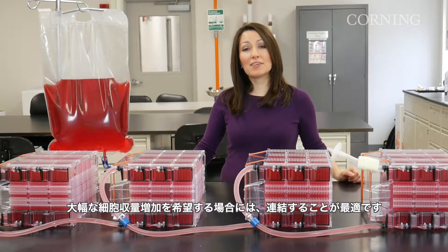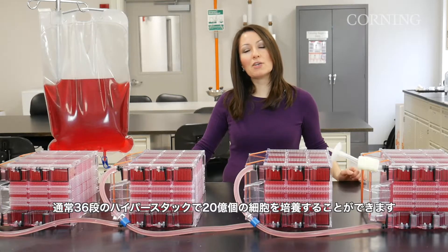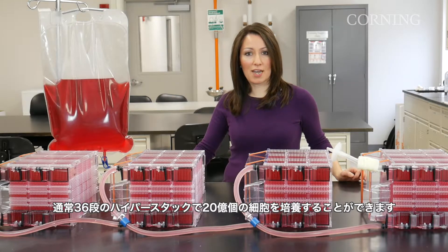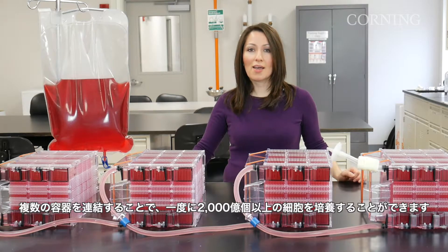For those who need significant cell yields, a manifolded setup is best. You can typically grow 2 billion cells in a single 36-layer HyperStack, but by manifolding several vessels together, you can generate 200 billion cells or more in a single batch.